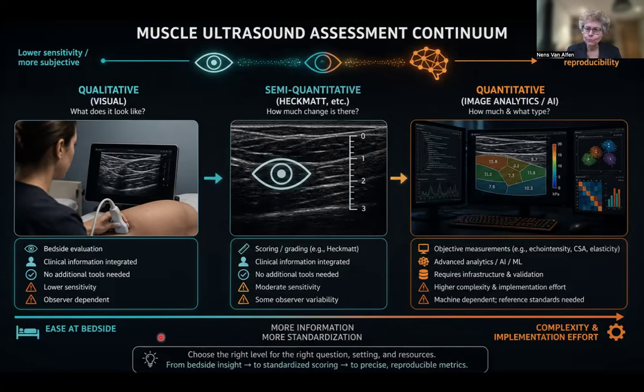If you want to make it a little more formal, use that 3-tier grading, like, okay, I think it's normal, I don't know, I think it's abnormal, and you will make your assessment a little more robust. And if you really want to go all the way, use objective numeric references, measurements, fat fractions, ultrasound echogenicity scores.